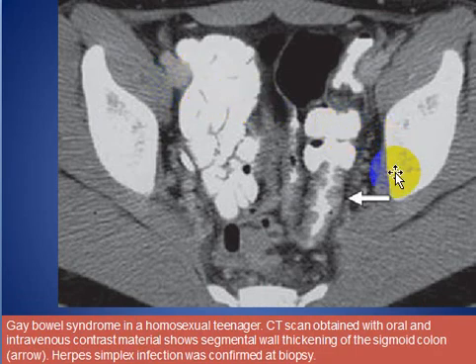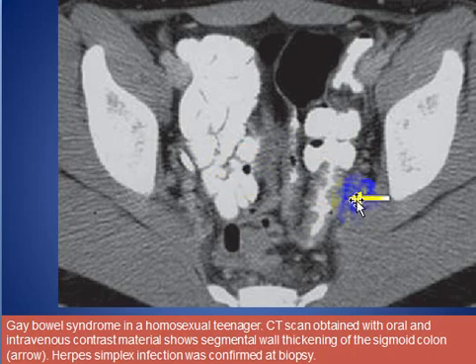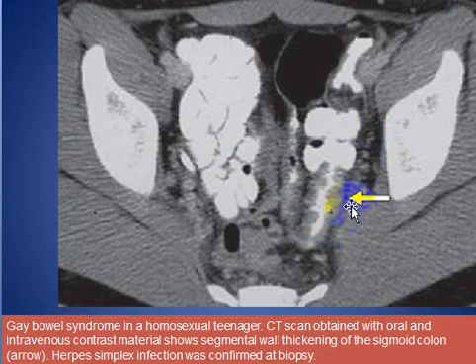Here is a patient with gay bowel syndrome in a homosexual male. We see some thickening of the wall of the sigmoid colon after oral and IV contrast, due to infection with herpes simplex, associated with some lymphadenopathy.